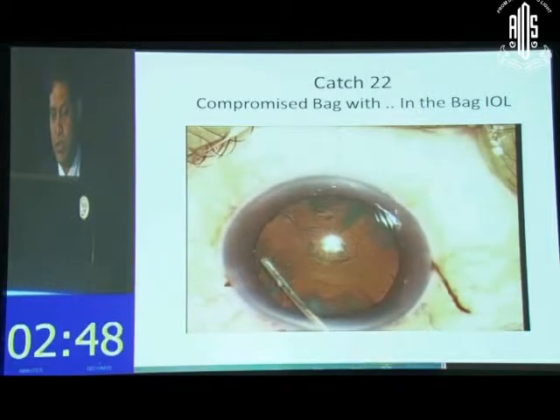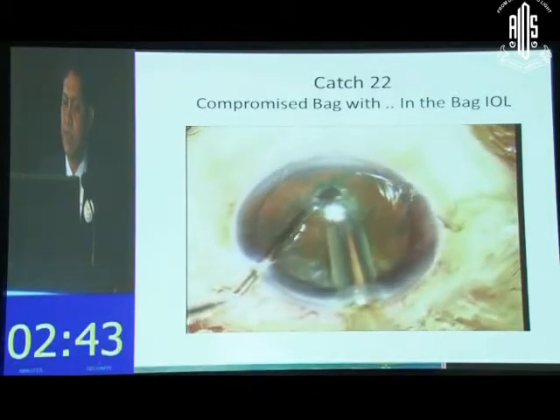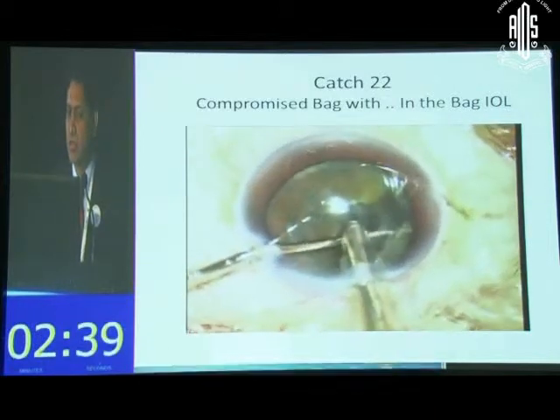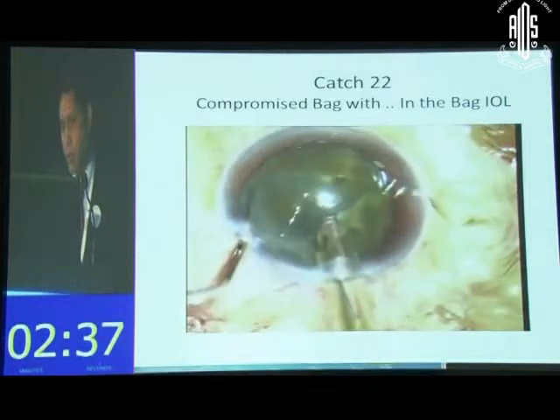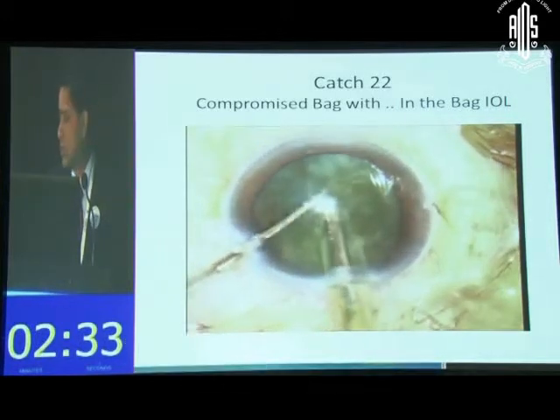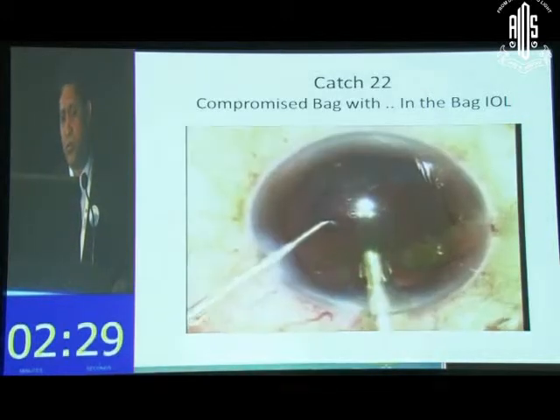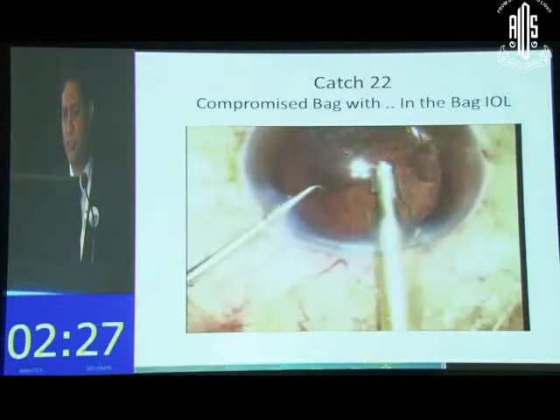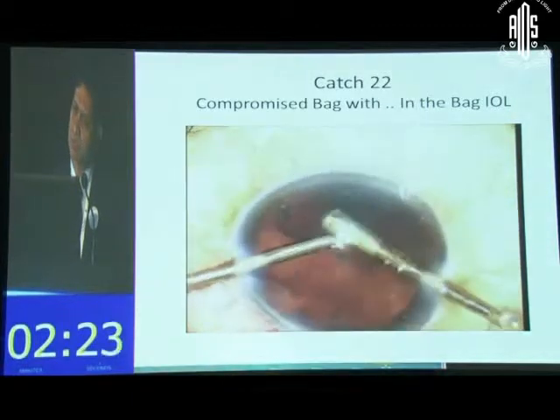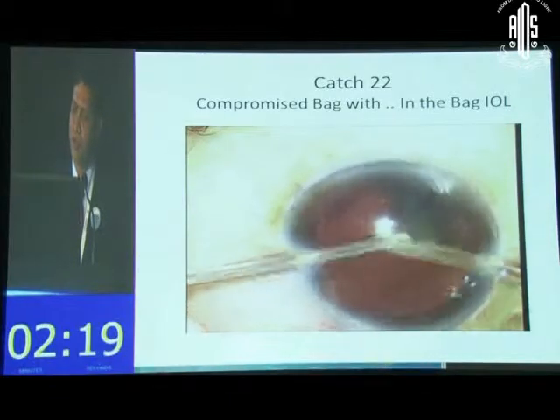So I was doing surgery, and this was not even a hard cataract. This was not even a moderate cataract. The patient was well known to me, my patient for a very long time. It was not a very hard cataract, so I was not going in for the regular chop. I was going for a stop and chop, and there we are. We have dealt with the nucleus. Happy story so far. The cortical cleanup also is uneventful.